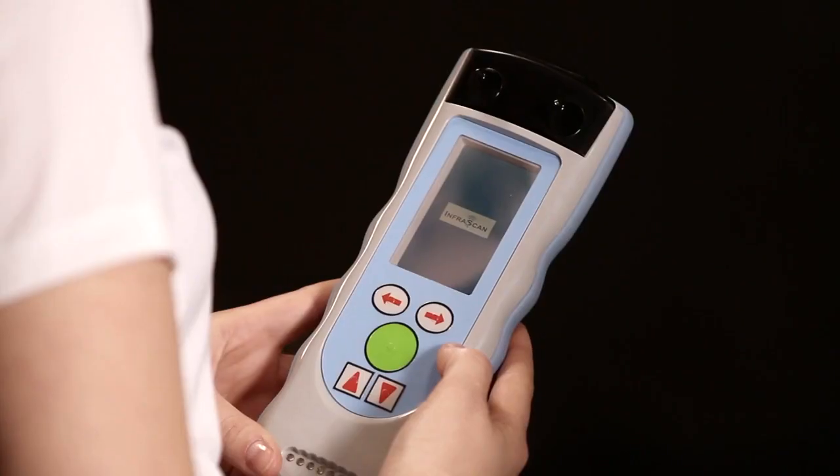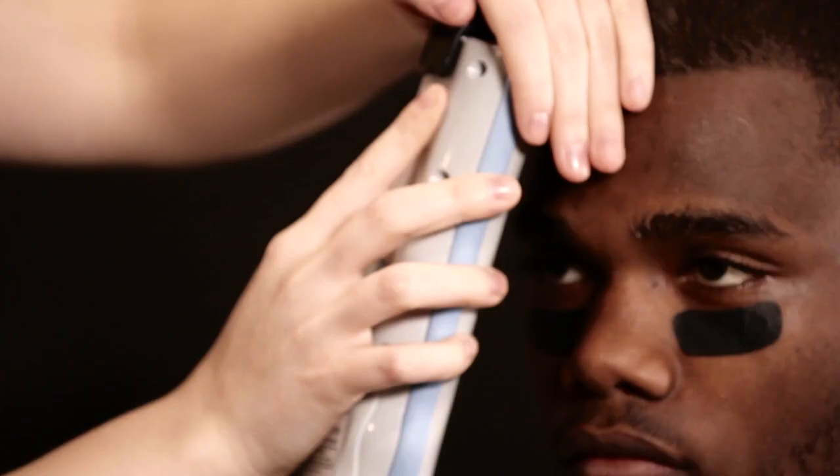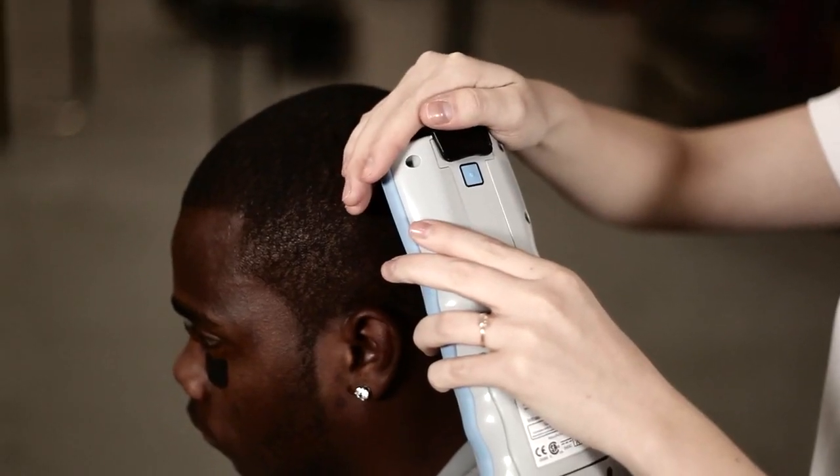Snap on the disposable fiber optic shield and then wait 15 seconds for the system to power on. You must take eight data points starting on the patient's left, moving to the right, for four separate data pairs, so that there are symmetrical readings on both sides at all four points. The pressure must be firm but not painful, and consistent and symmetrical on both sides — equal pressure on each side is essential to prevent an air gap and ensure accurate optical density measurement. When you press the button, immediately release it and you'll hear an audible beep. In a loud environment where you can't hear the beep, the screen will go blank, then flash back on when the scan for that region is complete.